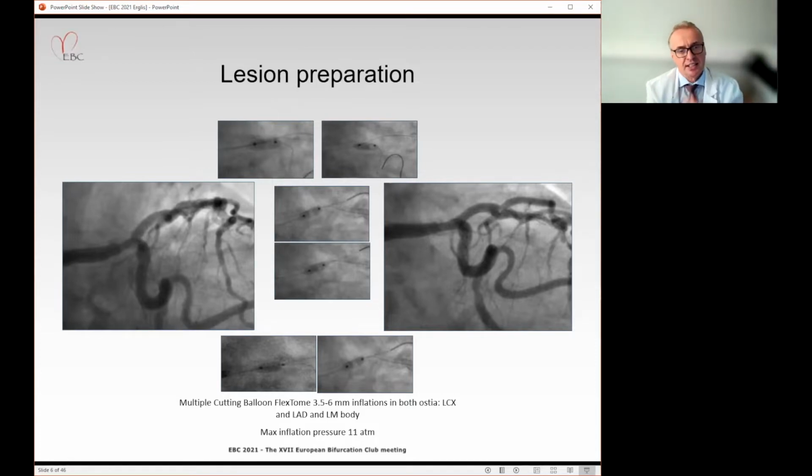But as I said, years ago it was, and it is still, important to understand that we prove the one stent strategy. But of course, in other cases we can't fix this if we use only one stent, and we need to prepare also for a second stent. But in this particular case, we really thought that maybe we will be happy with one stent.